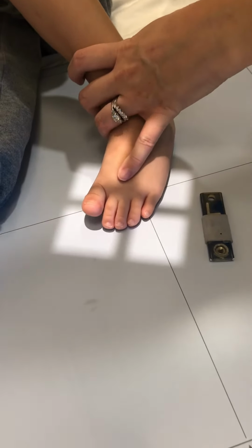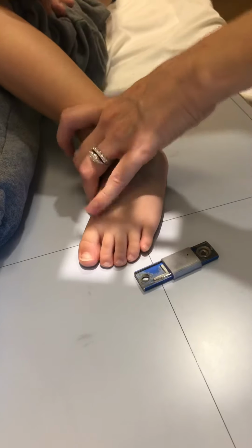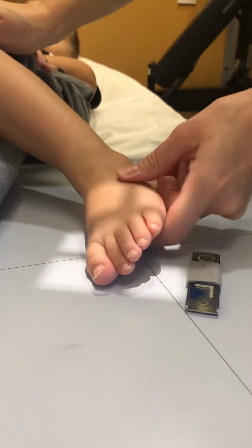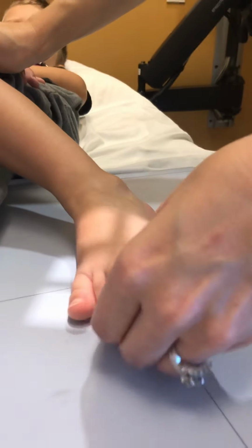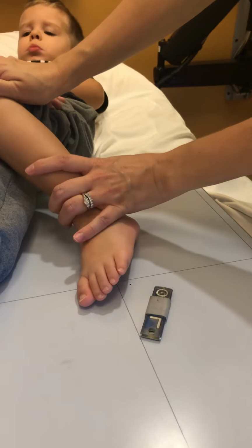So I'm keeping my hand on his foot, but I'm going to move it for the x-ray. I wouldn't necessarily keep it there. There we go. Marker. Squeeze it in just like that. So we're going to turn him just like so, and that same oblique that we would do for a normal foot. There we go. About like this.